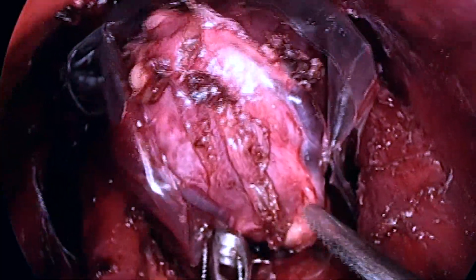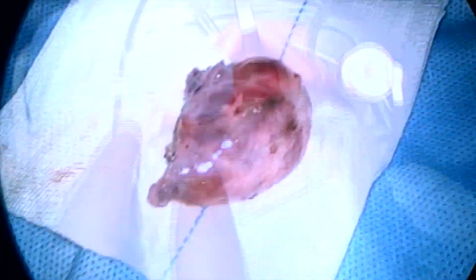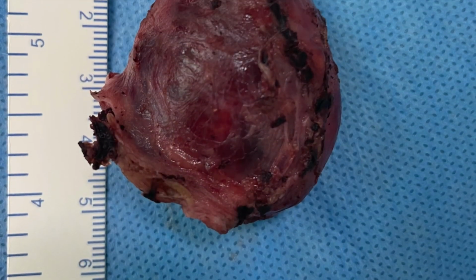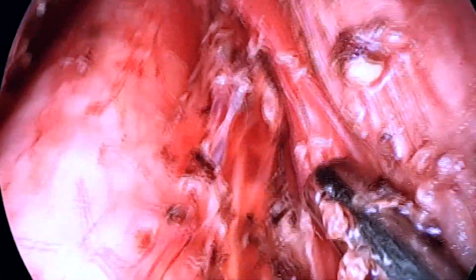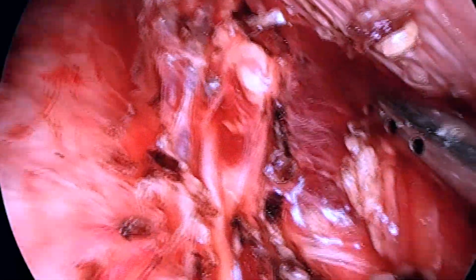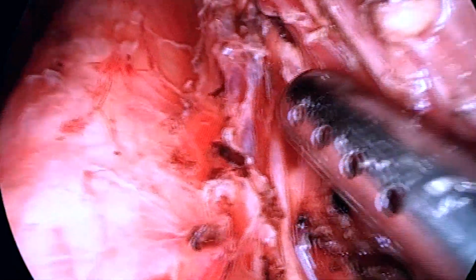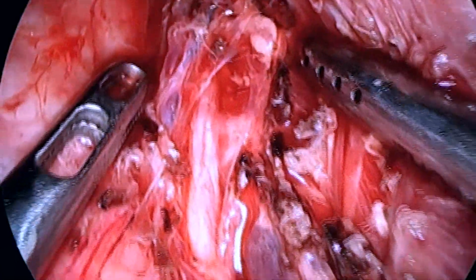Placing the specimen in the endo bag and recovering prevents any track recurrences and ensures complete removal of the specimen. A thorough saline wash to control and confirm hemostasis is then given, and the recurrent laryngeal nerve continuity is confirmed. The strap muscles can be approximated to cover the exposed trachea.